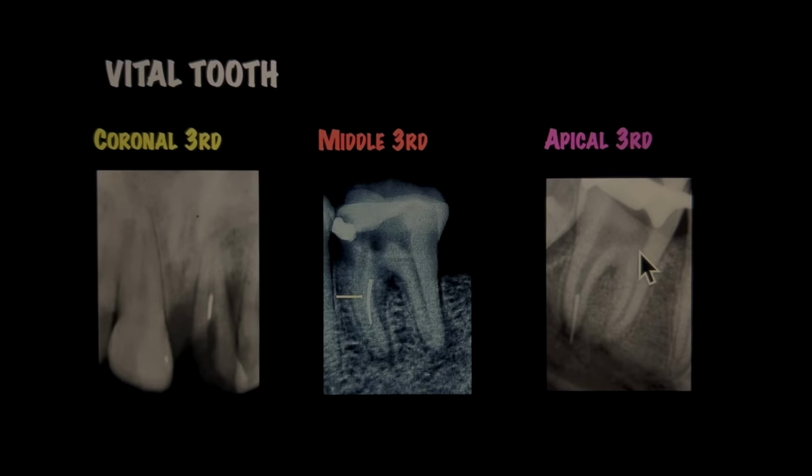If it is not possible, obturate coronal to the separated fragment in the apical third, and an immediate coronal seal is very important in a vital tooth. Obviously, before sealing and obturating coronal to the fragment, if bypass is not possible, do profuse and significant cleaning, that is irrigation, before you complete sealing the root canals.